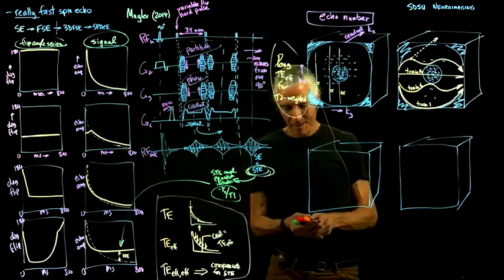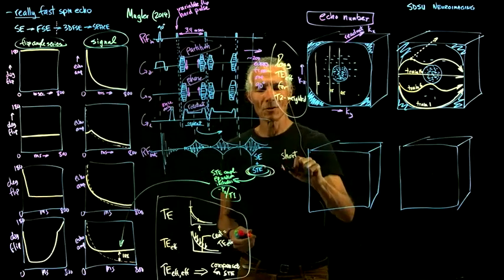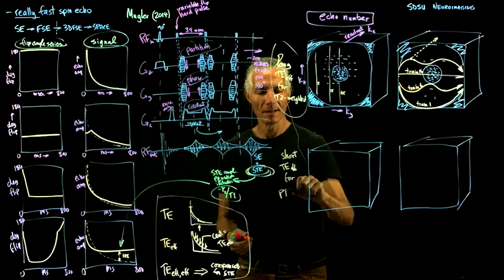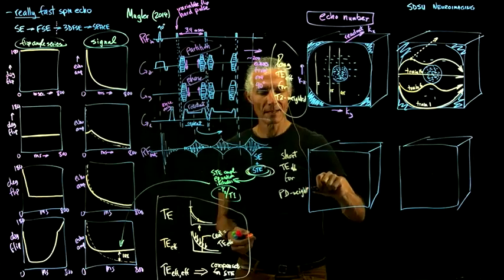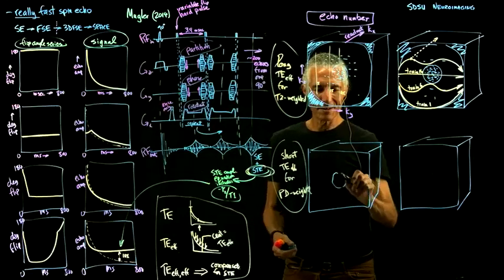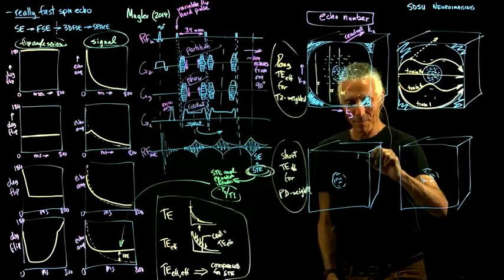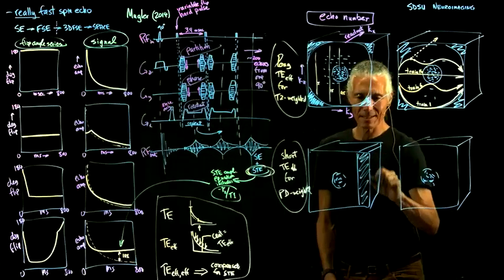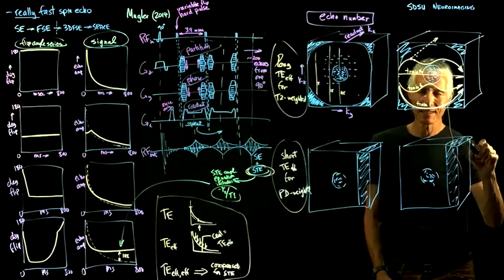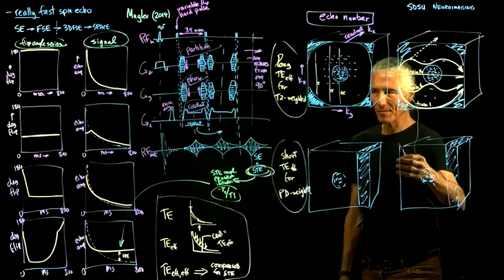And we've got a similar one. That was a long one, so this is a short TE effective, for proton density weighted. In this case, we're just recording more in the center of k-space like we were before. But in this case, we've got so much signal that we can just chop off part of k-space. So just don't bother recording this. And how could we do that? Remember, that was because of the funny symmetry of k-space. We can reconstruct what this data should have been from other parts of k-space because of the Hermitian symmetry.